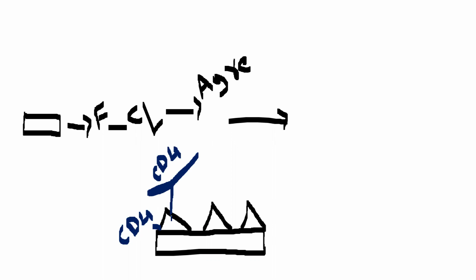But the problem is, antibodies are also colorless components. If they are colorless, I cannot visualize these antibodies. That is why I will label this antibody with an enzyme.